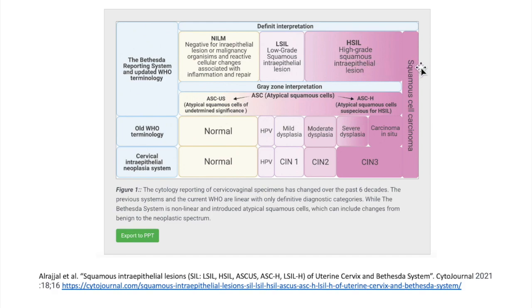Notice here that the authors of this figure used a color gradient of dark pink representing cancer to light pink representing the in-between stages. They use a color gradient because they're trying to communicate that interpreting which stage a cell belongs to can actually be very subjective and difficult.